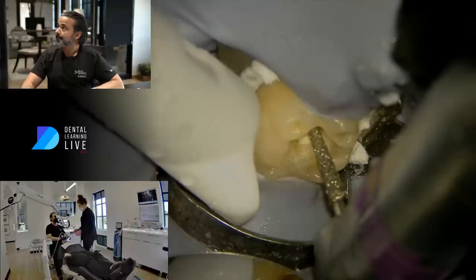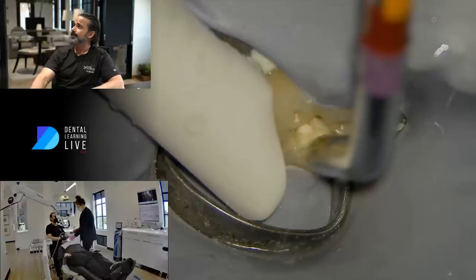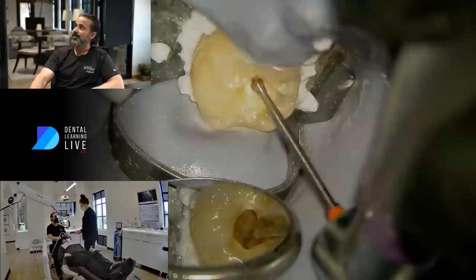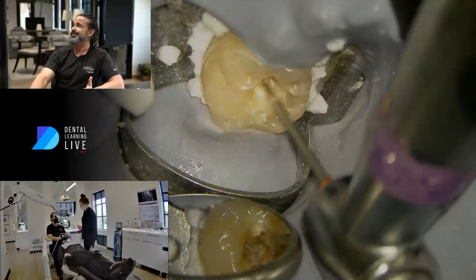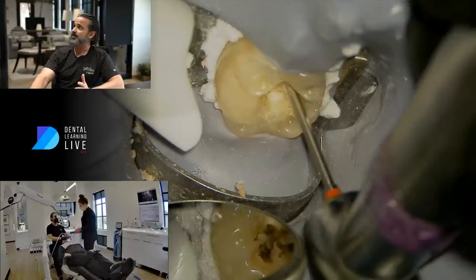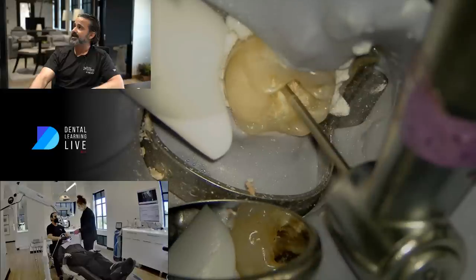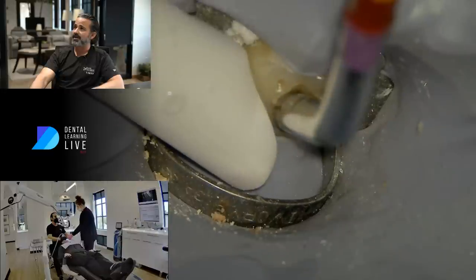There we go. In that process I'm bumping into the pulp horn already, even before I remove the decay. This is actually a Munce bur — you can use a slow speed bur or even high speed if you really wanted just to drop in. I'm showing the recurrent decay in there and the logic of why I removed the filling. It does affect my access shape — it's going to be not a ninja access by any means. All I'm doing is removing this leathery decay out of there and finding my anatomy. I'm going to look into where the orifices are and identify the hyperemic tissue.